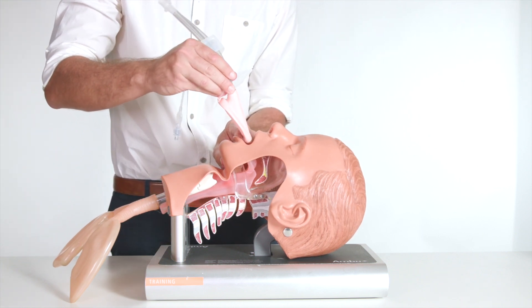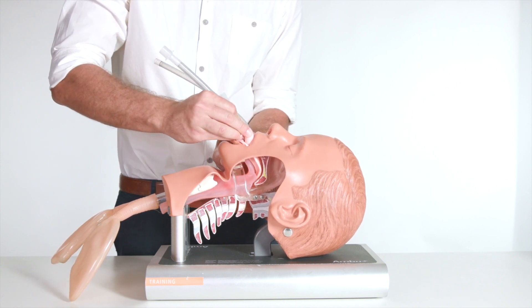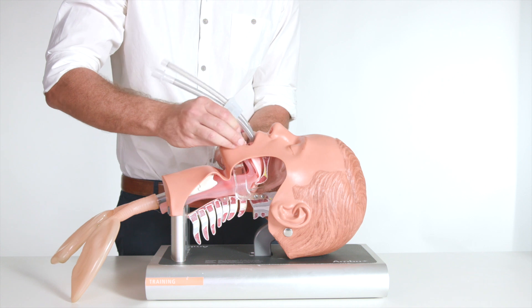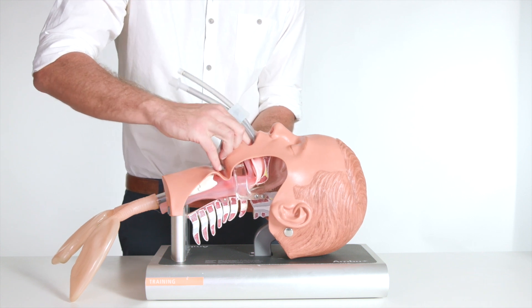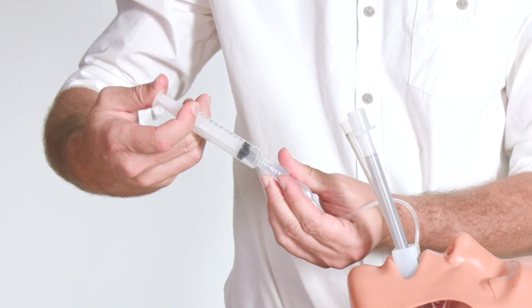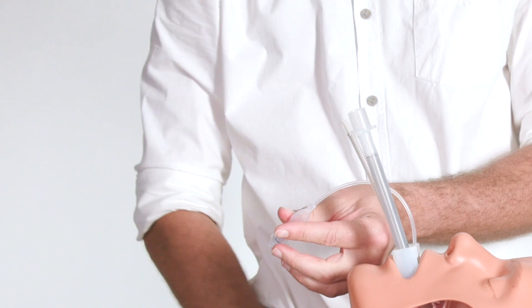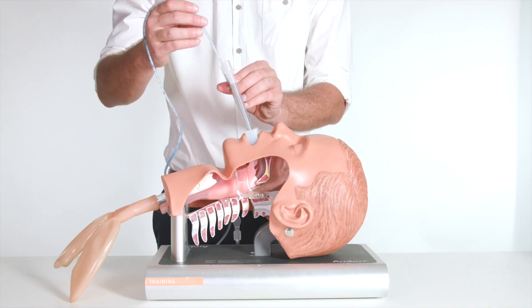Insert the LMA along the hard and soft palate, guiding the mask through the natural bend of the airway with a finger or with the aid of a laryngoscope to lift the base of the tongue. Advance until resistance is felt. Create a seal by inflating the mask cuff and check the pressure, then confirm the mask is placed correctly.